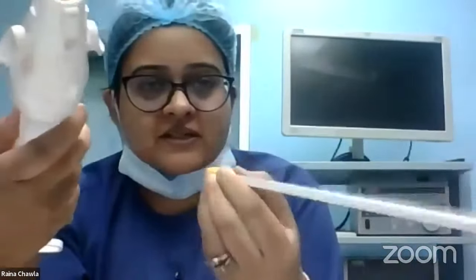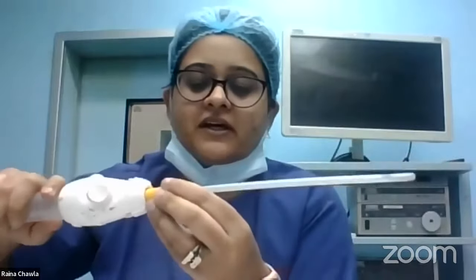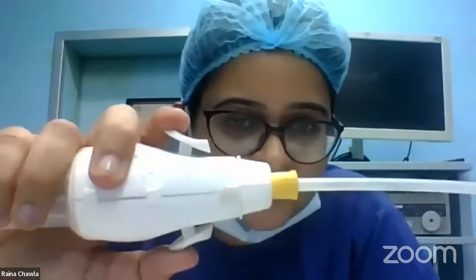This loaded syringe: the Karman's cannula is in the cervix, just beyond the internal os. I attach this loaded syringe to the Karman's cannula, and then I release the pressure by pressing these two. Now listen carefully. You will hear the release of pressure.